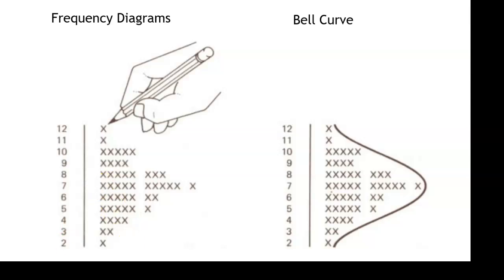Now, when deciding whether to recommend a dose change, Dawn isn't only interested in whether the current result is within or outside the therapeutic target range. It also wants to know how far from the target INR the current result is, but also how frequently other similar results have been occurring. And what it's doing is applying statistical process control techniques.